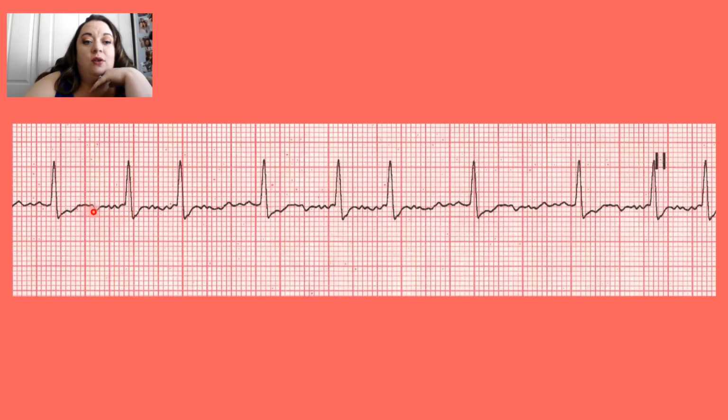Technically each little waveform represents atrial contraction. Instead of 1 P wave with 1 atrial contraction, the problem with fibrillation is that your atria are quivering. They have all these multiple little contractions. So you can't measure the PR interval on these, it's just unobtainable. So my rate's 100, it's irregular, I don't have 1 P wave for every 1 QRS, and I can't measure my PR interval.